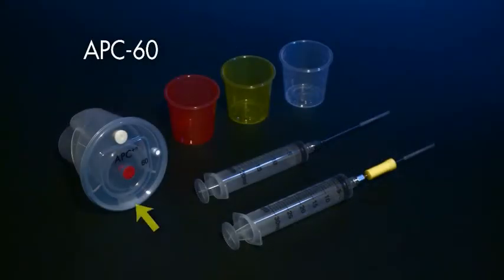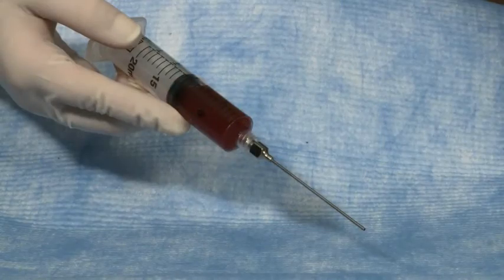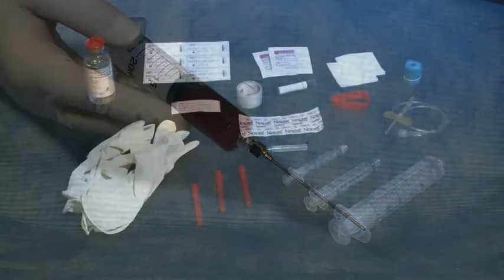The kits include a process disposable, sterile cups, plasma syringe, and a platelet concentrate syringe. The APC 60 disposable processes 60 ml of anticoagulated whole blood yielding an Autologous Platelet Concentrate APC product between 7 to 10 ml depending on the need for a particular procedure.